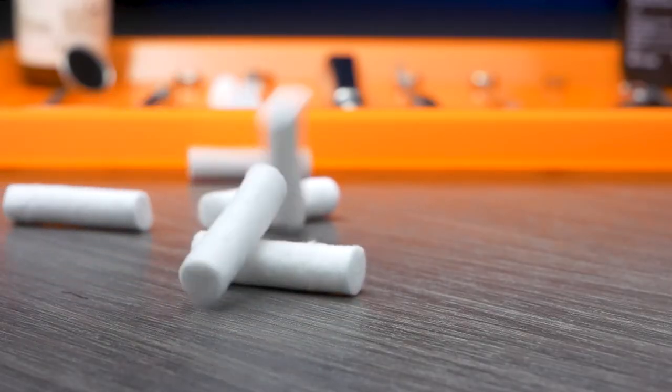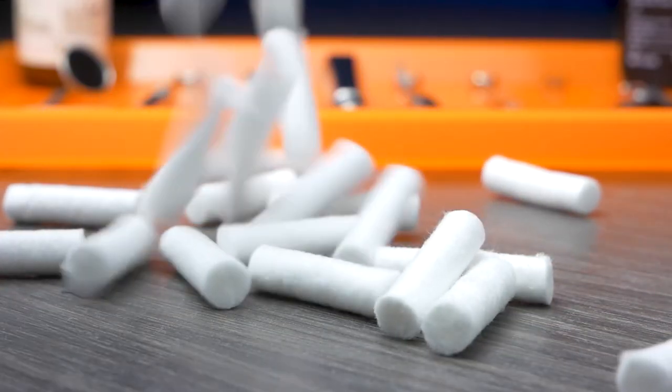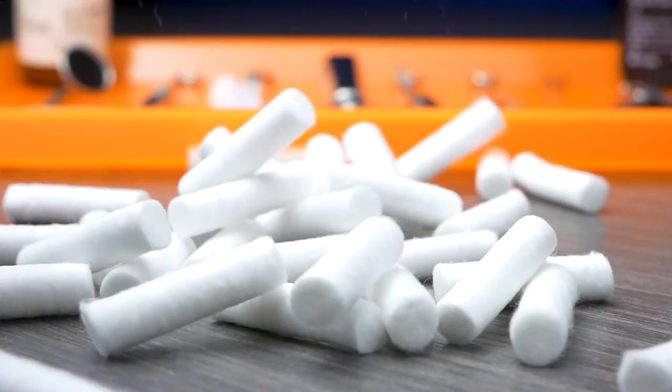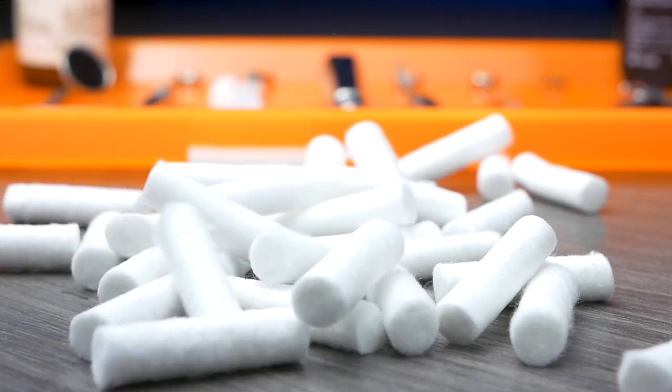Cotton rolls may also be used. The purpose of this is to keep the operative area free of excess moisture.